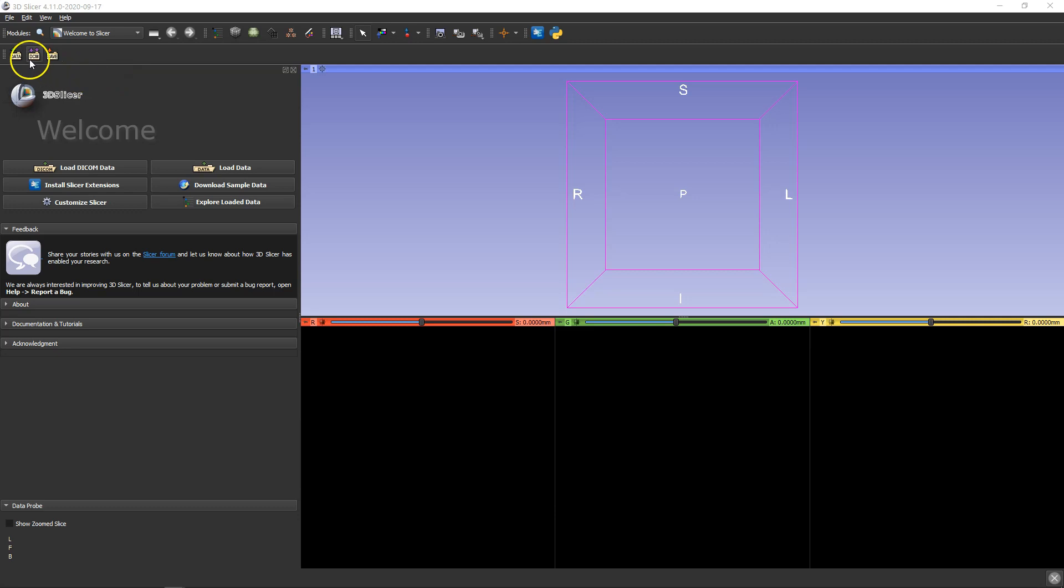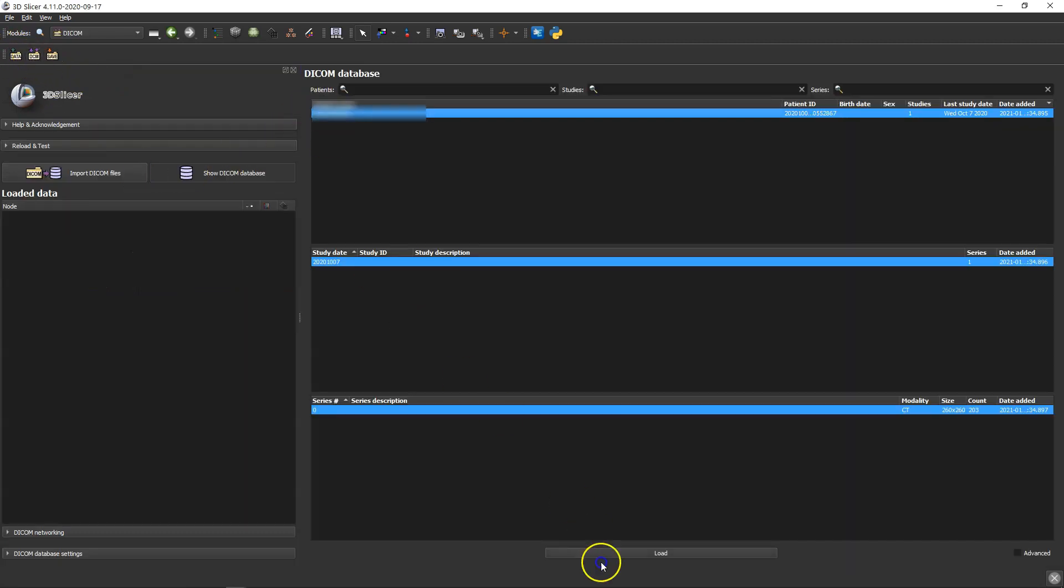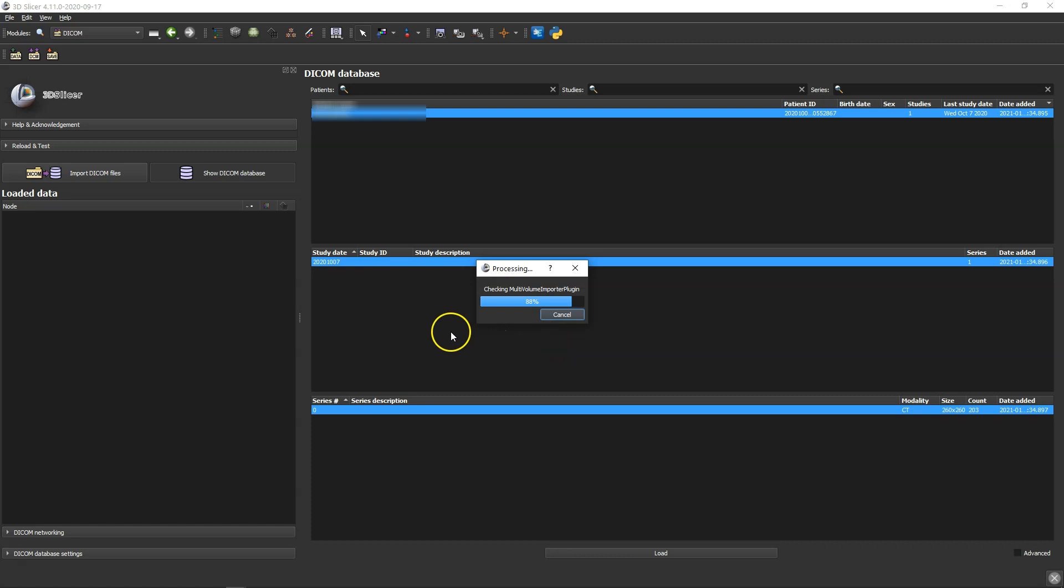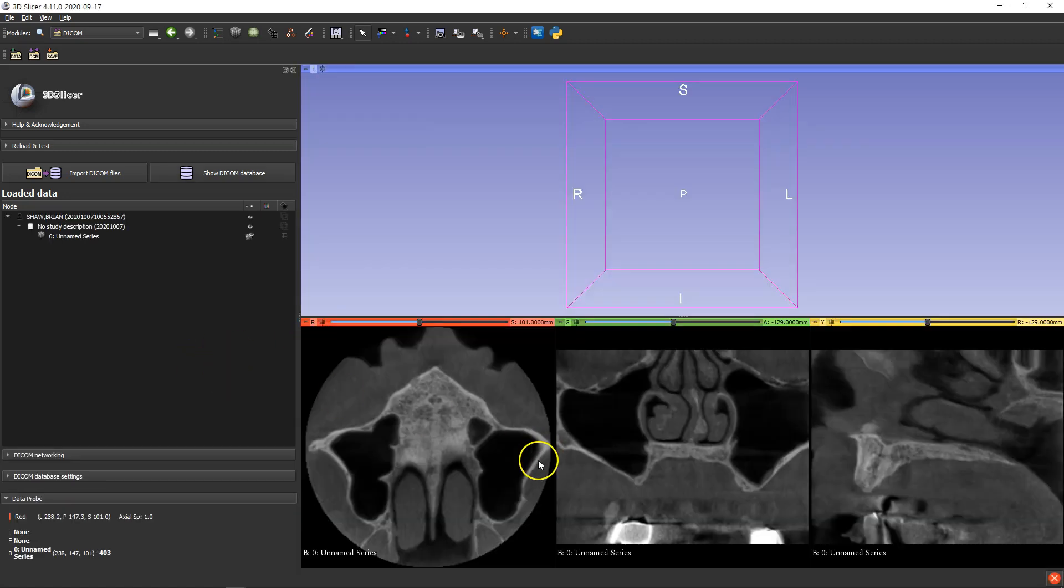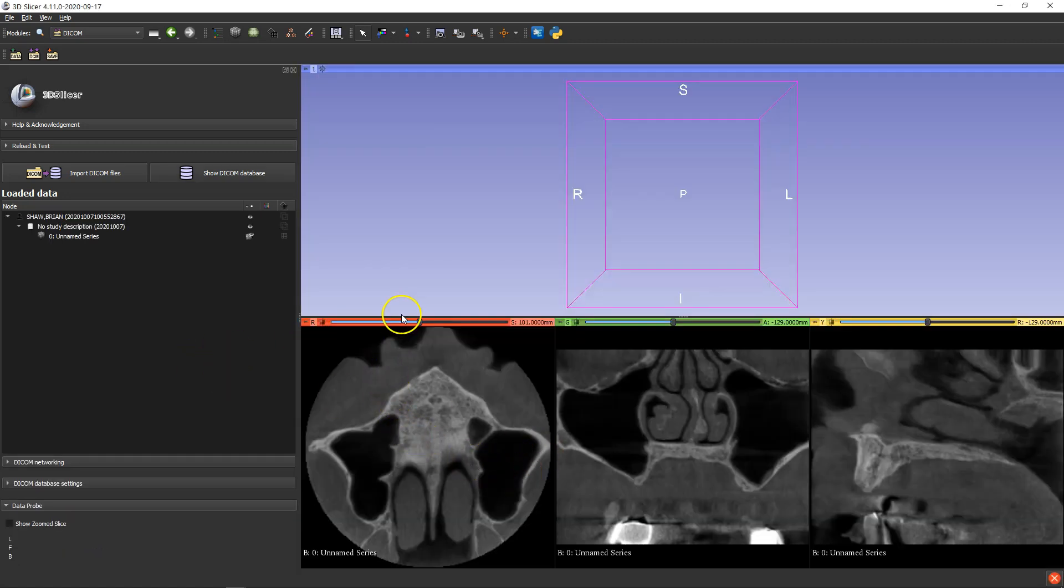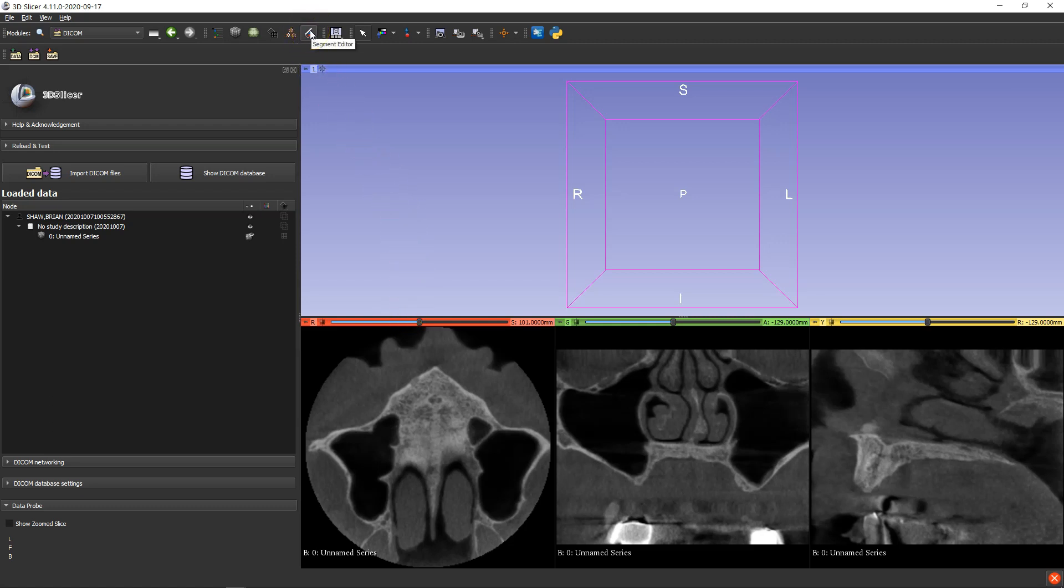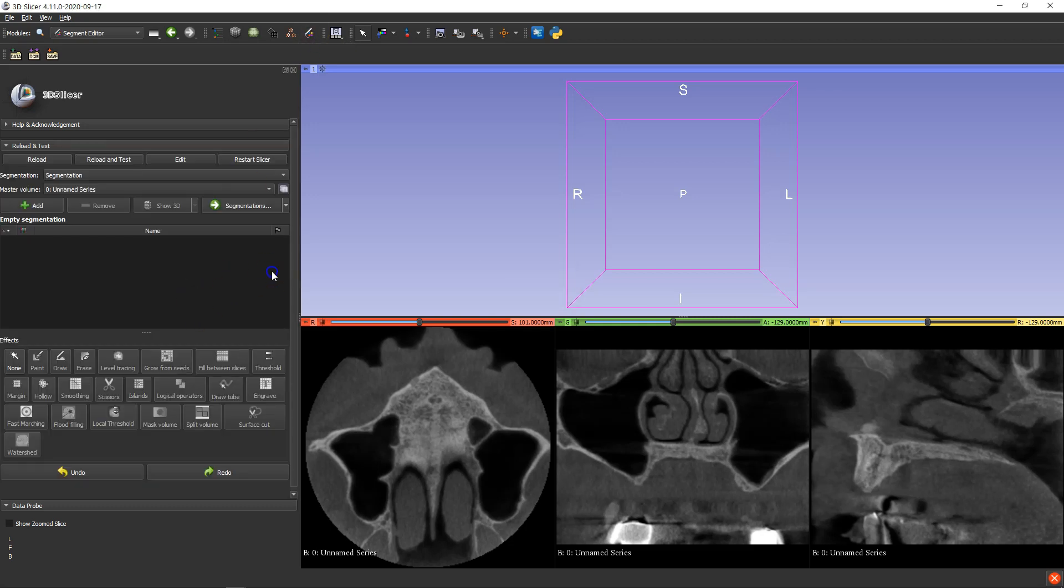So first of all we're going to bring in the DICOM file and then we're going to head straight over to the segmentation, which is this little icon here. It's the segment editor. Make sure you get this icon and left click it.